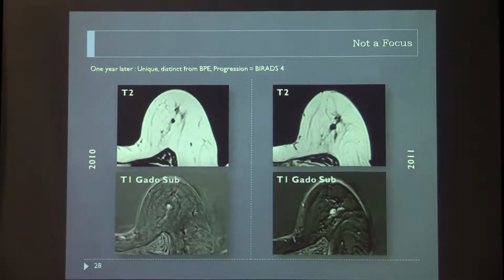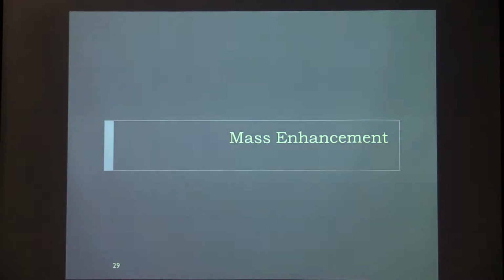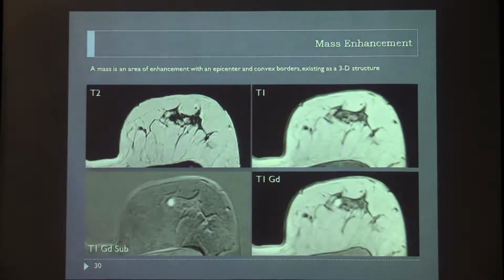You have to pay attention to that. It's really important. Even if the MRI says there is nothing, it looks benign, you have to perform an ultrasound and biopsy this lesion. It is not normal to have this clinical symptom. So I should, in 2010, have performed an ultrasound and biopsied the lymph node, even if it looked normal, because of this symptom.